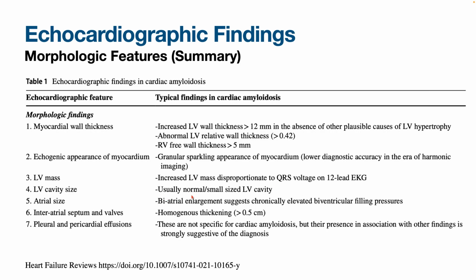The LV cavity is usually normal or small. The atrium is often enlarged because of diastolic dysfunction with elevated filling pressures. The interatrial septum and the valves are often thickened.